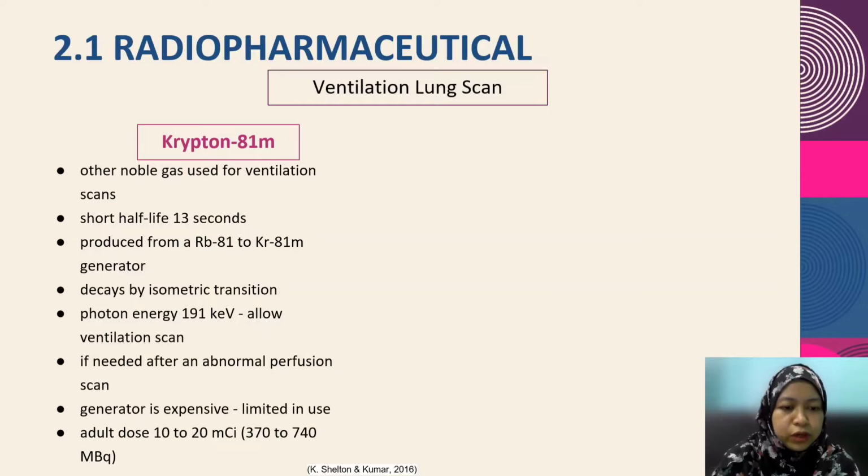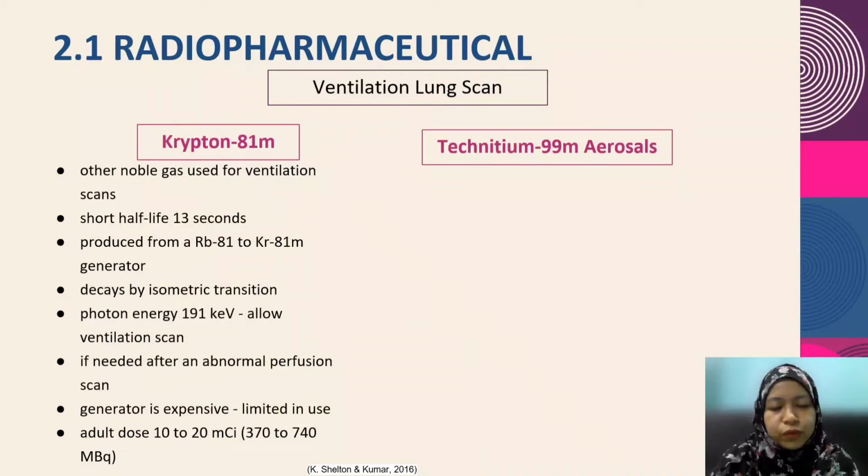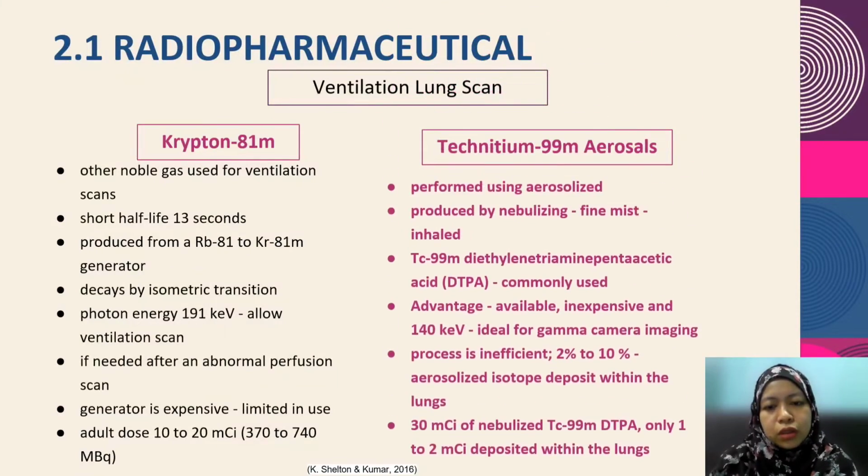The fourth one is technetium aerosol. Ventilation scan can also be performed using aerosol rather than gaseous agent. Radioisotope labeled aerosols are produced by nebulizing radiopharmaceutical into a fine mist that is inhaled. DTPA is commonly used for radioaerosol.